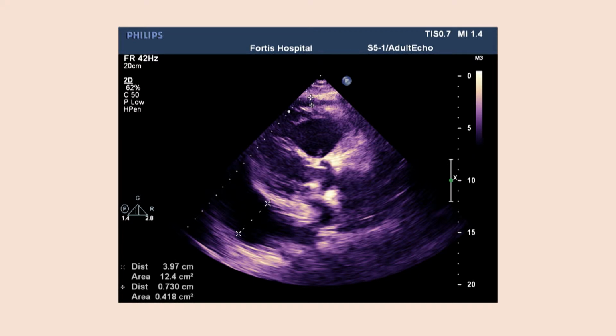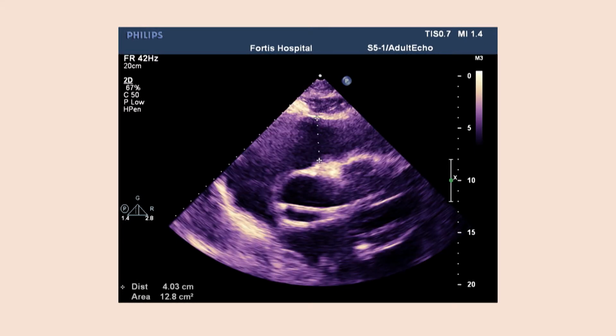This patient, while I was doing echo, in fact, was having a very tender epigastrium, probably due to tender hepatomegaly. And this is the measurement of the pericardial effusion from the plax view and from the subcostal view. And he underwent pericardiocentesis yesterday. 1.5 liters of fluid was taken out, and repeat echo was done bedside, which showed mild pericardial effusion, and the RV dysfunction persisted with a widely open tricuspid valve.